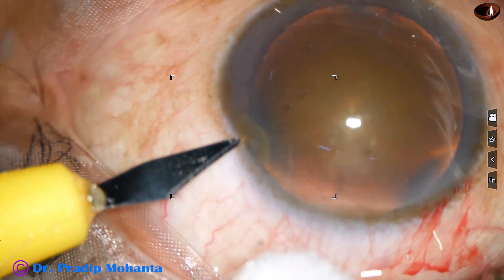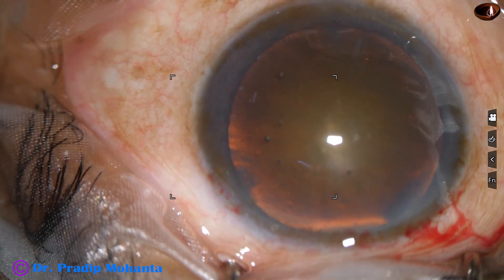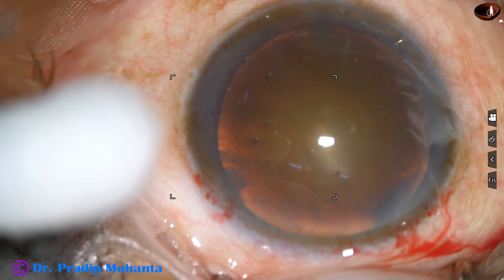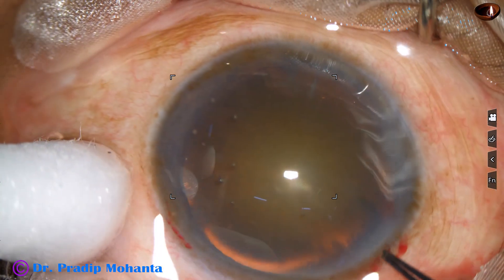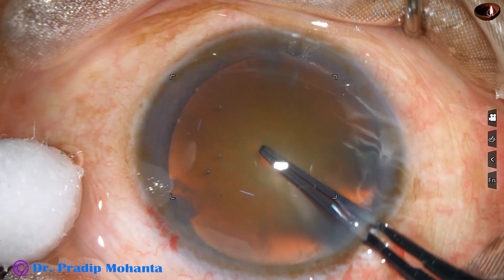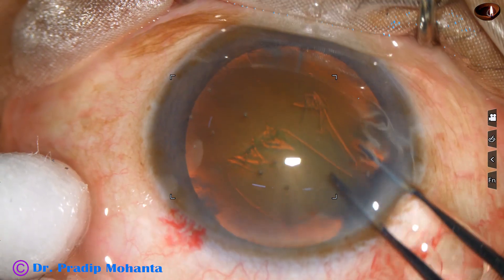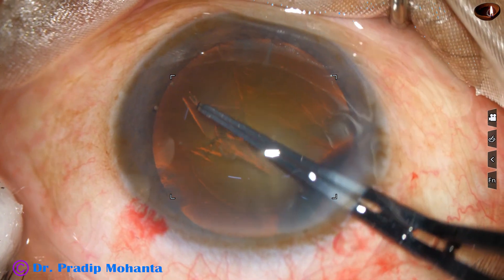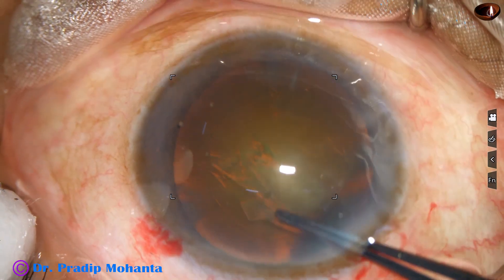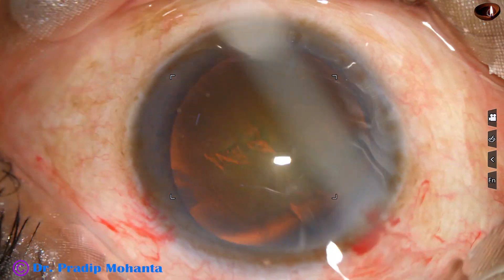This is a side port on the left side of the main incision. Capsulorhexis is done with the help of a utata forceps. Visibility is quite good. With anticlockwise movements of the capsular tag, the rhexis is completed.